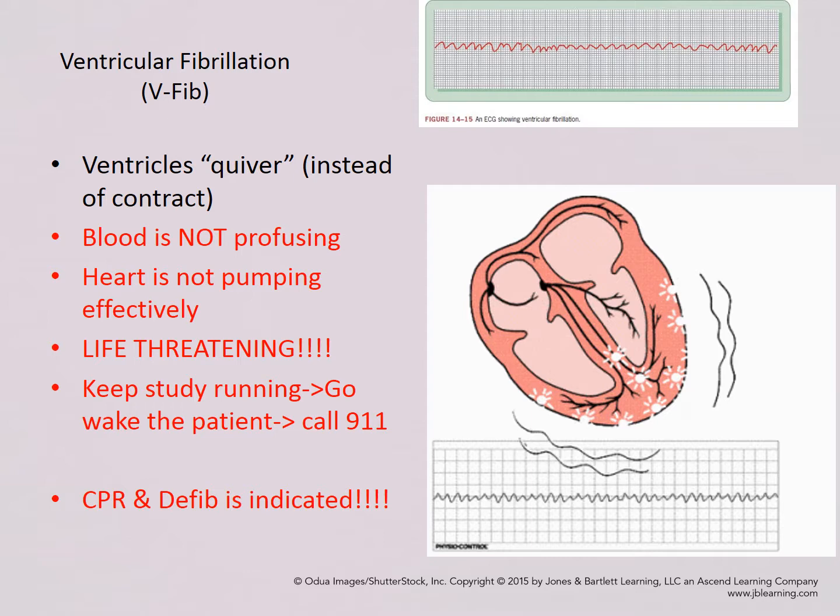This is life-threatening. Again, keep your study running. Ask your coworker to call 911 while you go wake the patient and start CPR, and defibrillation is indicated with this rhythm. Let's go on.